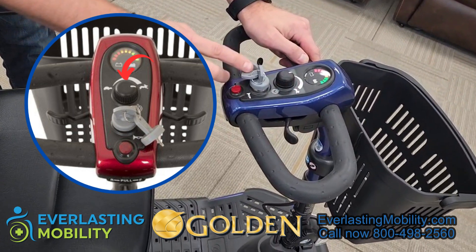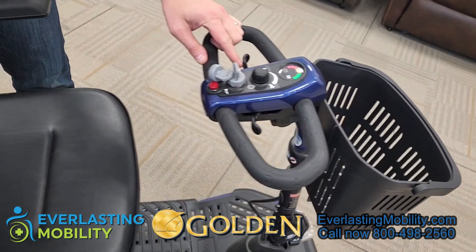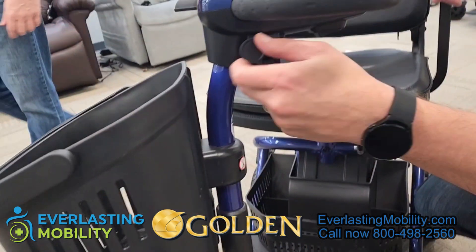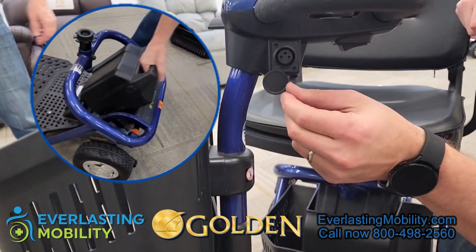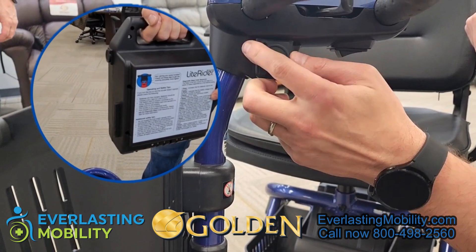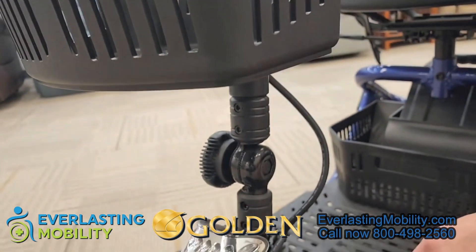It does come with two keys. There's also a horn button here. The tiller on this unit is a delta tiller with ambidextrous control, so you can operate the scooter with just one hand — accelerating forward and reversing with either hand. There's also a second charging port on the tiller itself, or you can remove the battery, bring it inside to charge, and then reinsert it when you're ready. The headlight switch is underneath the tiller — just a simple switch to turn it on and off.